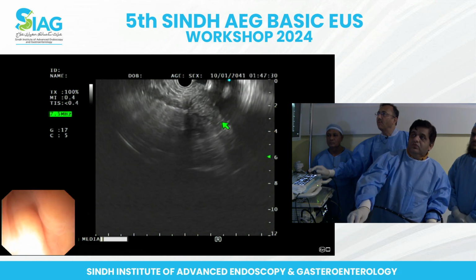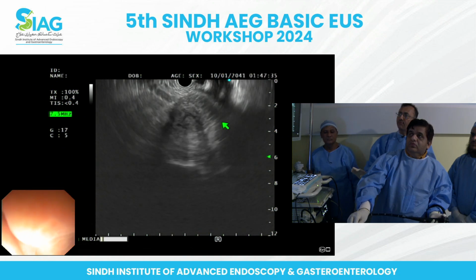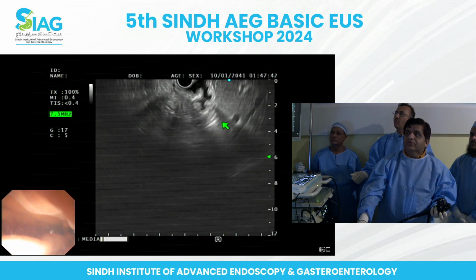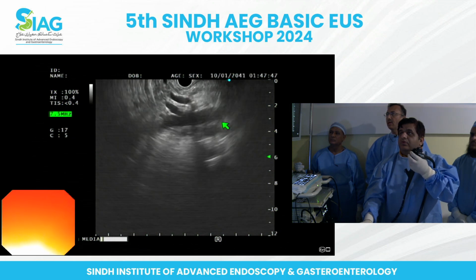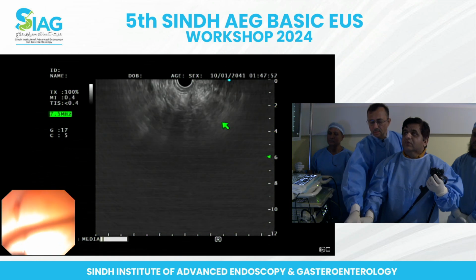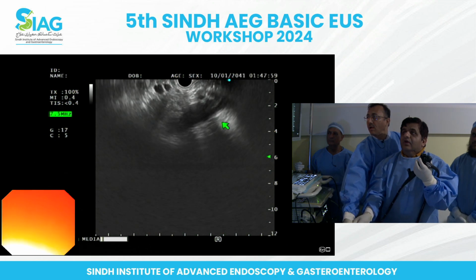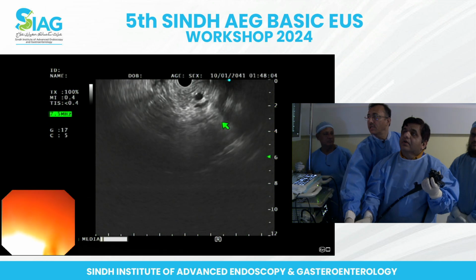Fair enough. Now you're likely to lose it if you're not careful with your movements and you are not gentle with your movements. So you've lost the area. Once again go back to the previous structure. This is the pancreatic duct.